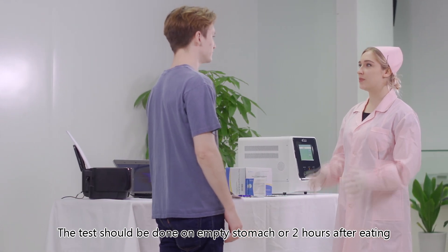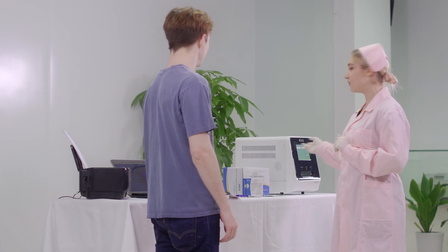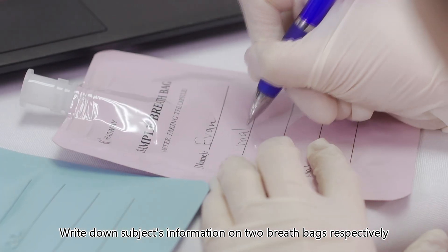The test should be done on an empty stomach or two hours after eating. Write down the subject's information on two breath bags respectively.